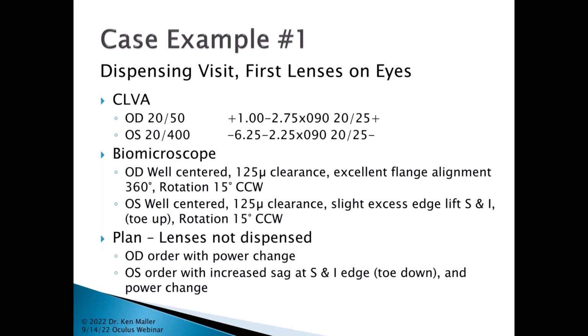So my plan was not to dispense the lenses because I was off by quite a bit on the power. So I ordered a new right lens with a power change and a left lens. I did increase the sag at the superior and inferior edge to bring that toe down a little bit. And of course, I put in that power difference as well.